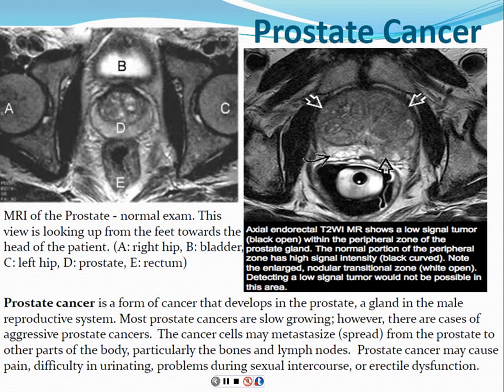Like with the cervix, the prostate just kind of looks like a gray blob on CT, so it's not great at differentiating structures and it's not great at finding cancer. That being said, we're still in the early stages of optimizing, detecting and understanding prostate cancer with MRI.